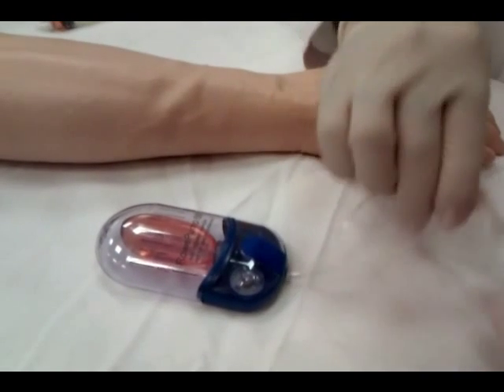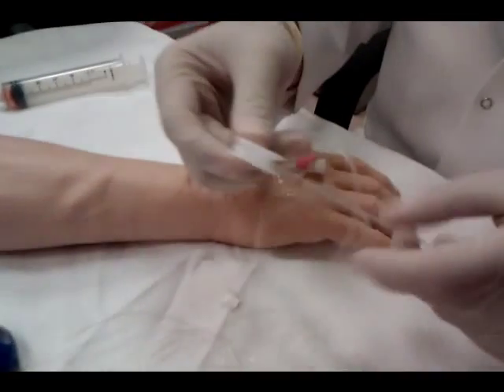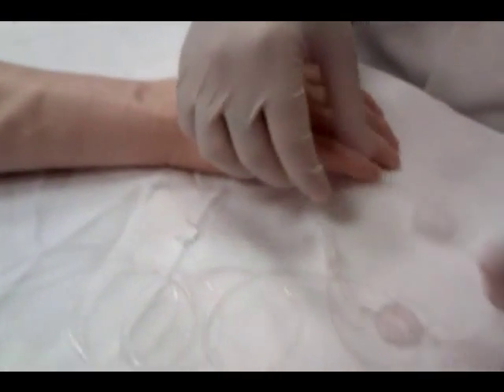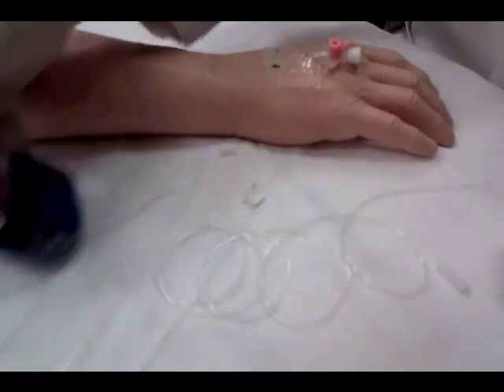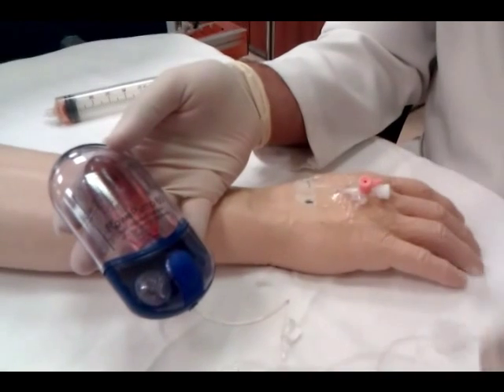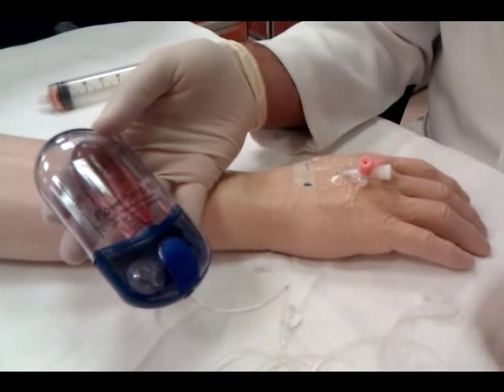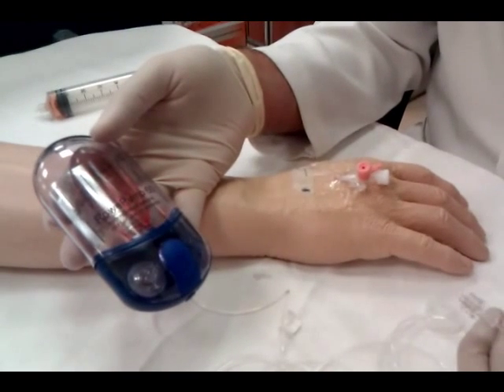Sure, you should unlock it to allow the medication to go outside. This is how to unlock. Very simple. And then it will start emptying the medication and the air bubbles. By the way, the Rowe Pump is a color-coded infusion pump. The blue one can have a flow rate of 2.5 ml per hour. We have many types of them, starting with 0.5 ml per hour up to 10 ml per hour.